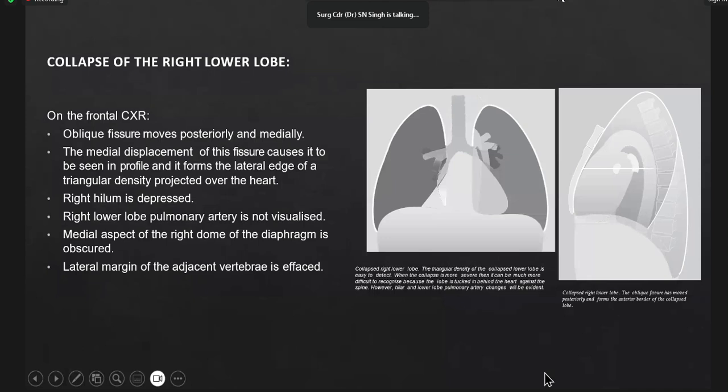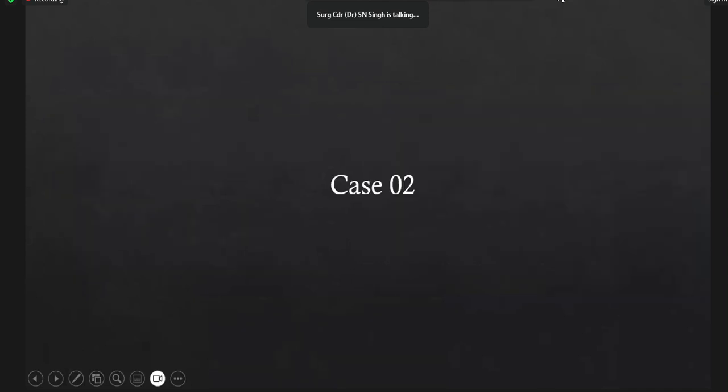Okay. So let us come to case 2. I think we are already 30 minutes in. Okay. Who will take this? Yes, sir. Me, Milan. Hi, Milan. Hi, sir. You take this. Describe it.